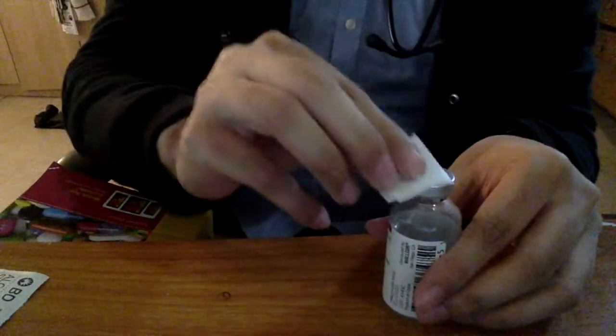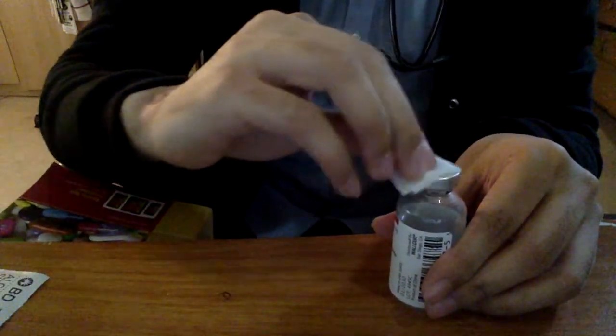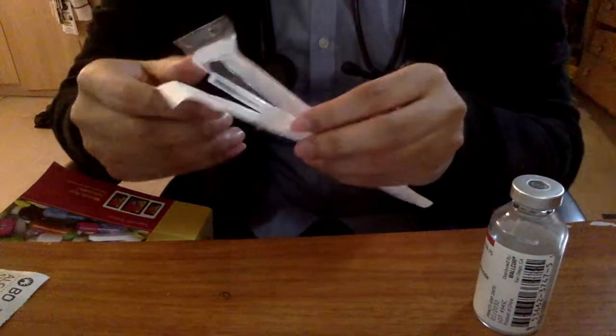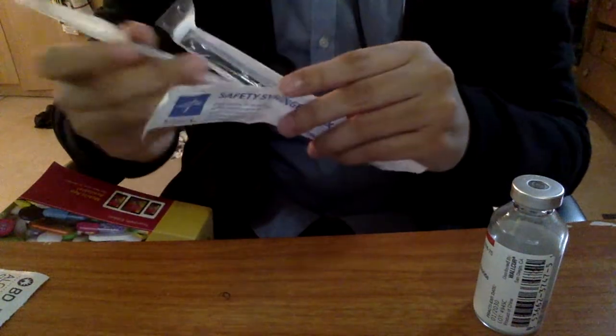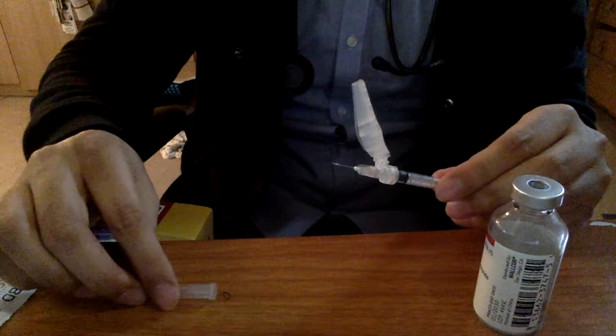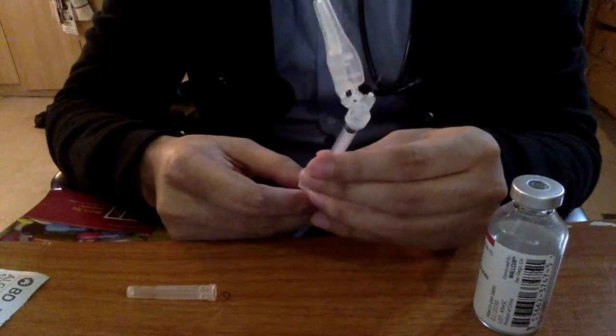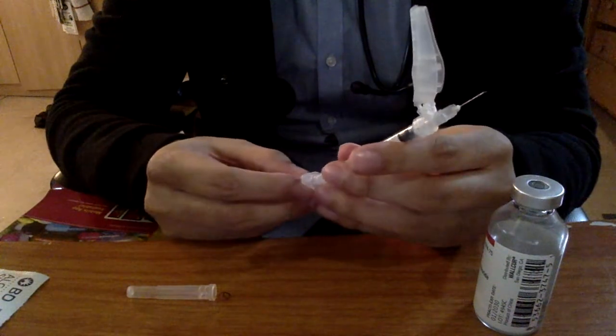So what we're going to do, we're going to take our alcohol swab. We're going to wipe the top of the vial in a circular motion. We're going to take our syringe. I'm going to take the cap off. I'm going to place it on the table. Okay. So now, since we are going to administer 4 units, we're going to draw back 4 units of air in the syringe.